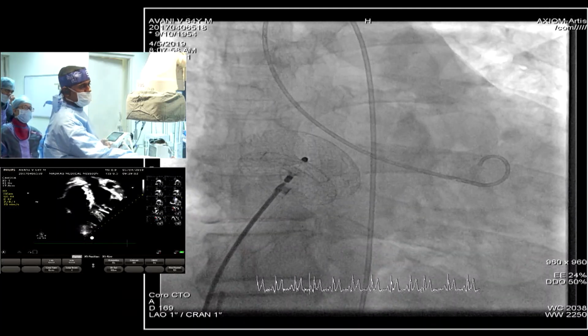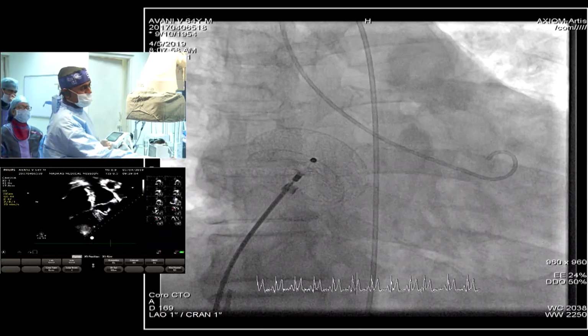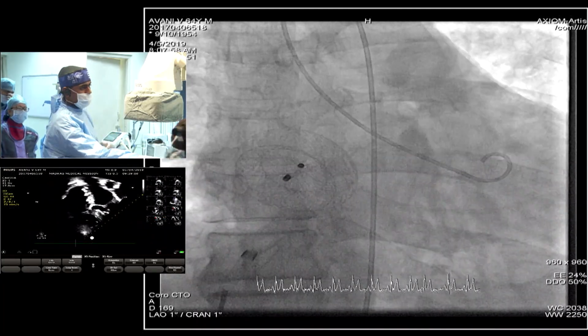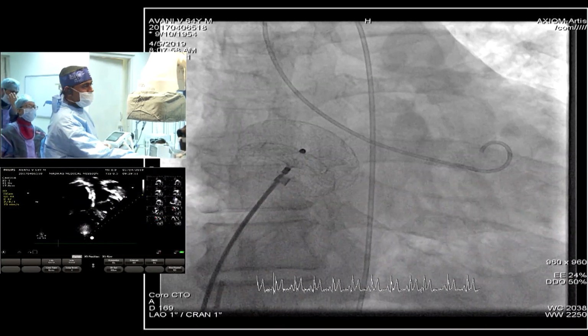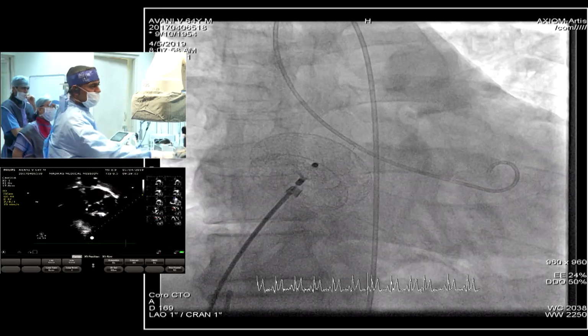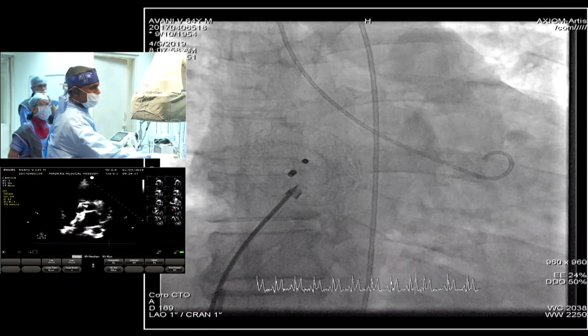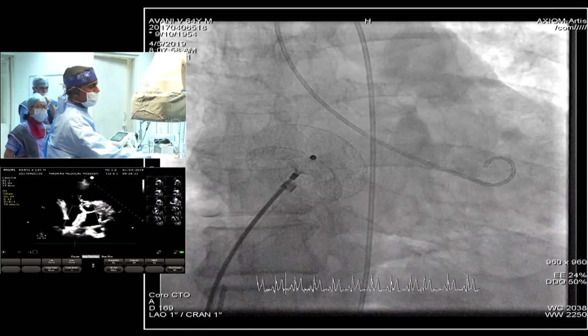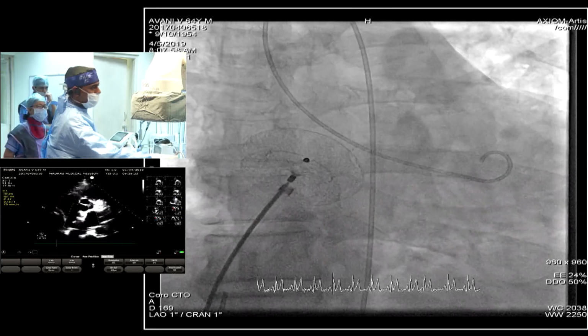2017 end or maybe 2018. It's called a snare assisted technique of release of ASD devices. Right now, as I am talking to you, I am showing an apical 4-chamber view for quite some time. You can see that the device is rather sleek because we have not oversized. In general, in India, we don't oversize more than 3, 4, at the maximum 5 millimeters. And so, fortunately for us, we don't see erosions at all.